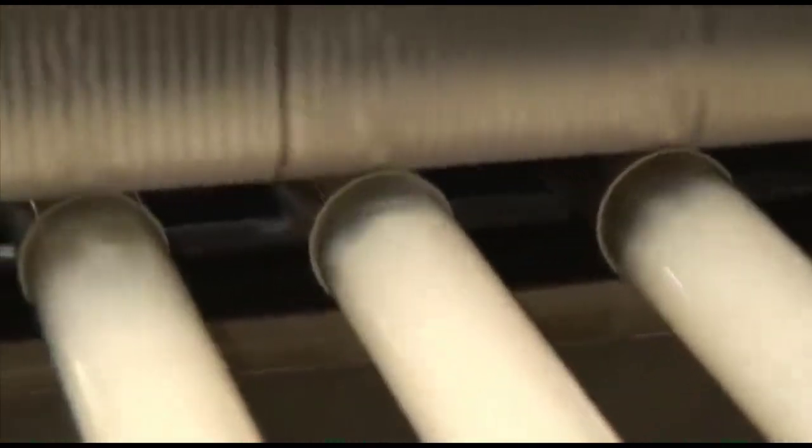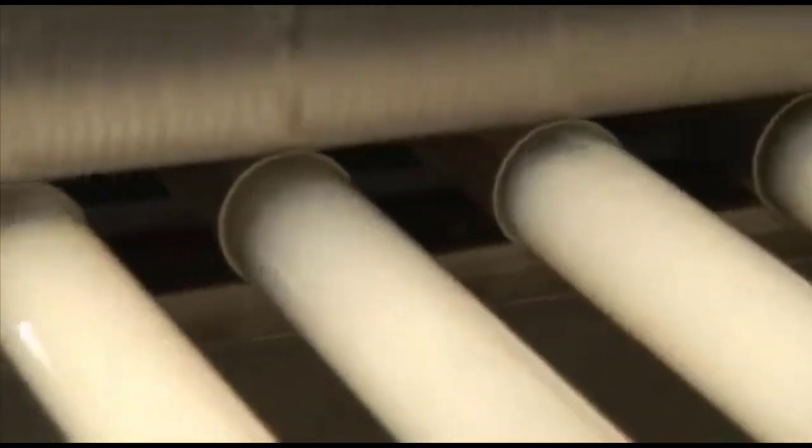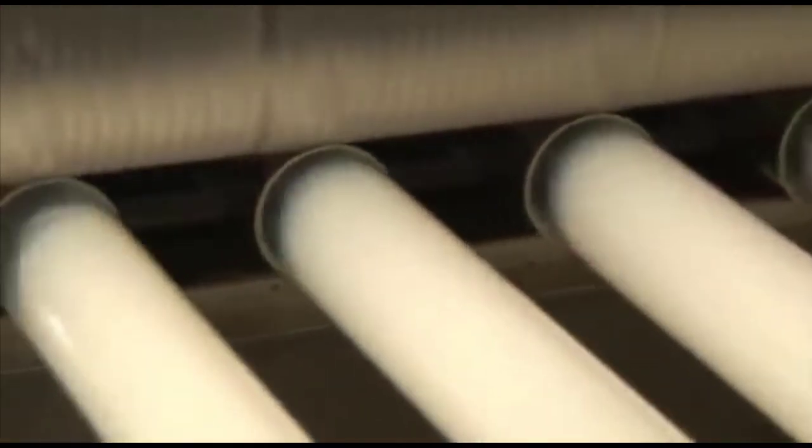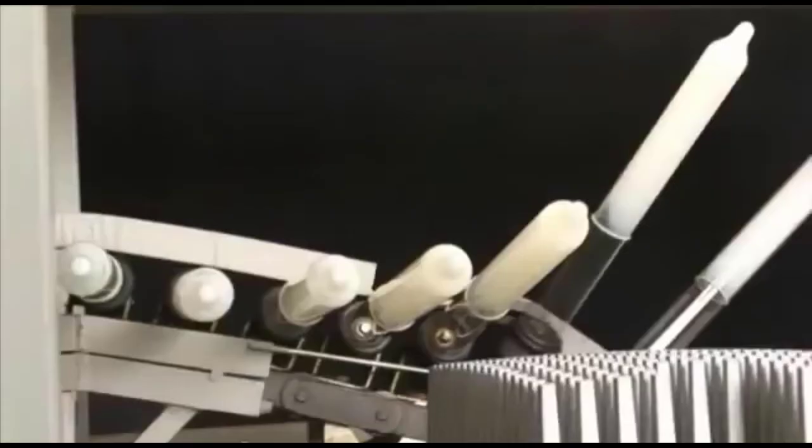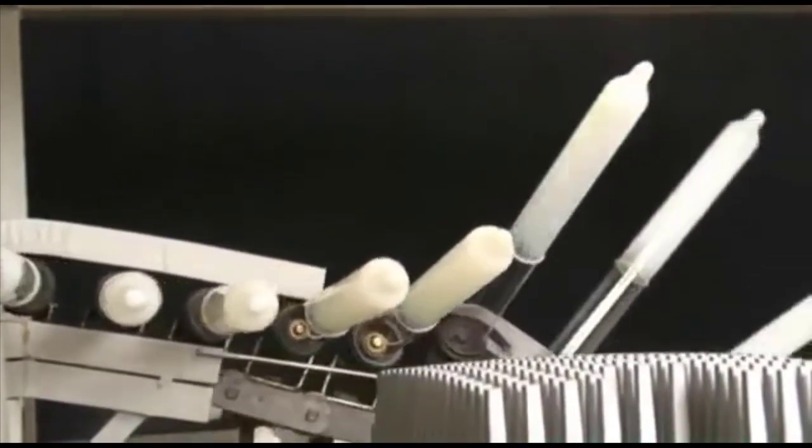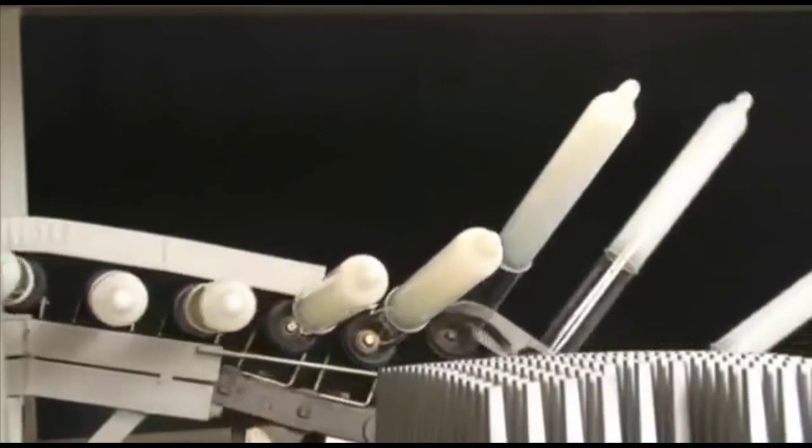Another important processing stage of condom production is the creation of the rolling rim. For this, every condom is given a rim at the open end of the former that can be rolled down. A final drying process called vulcanization makes sure the condom has the required elasticity.